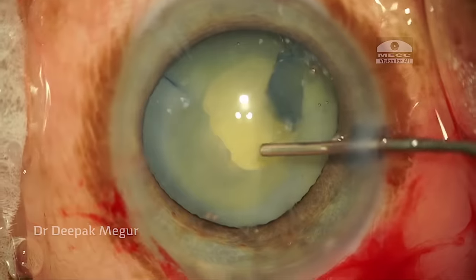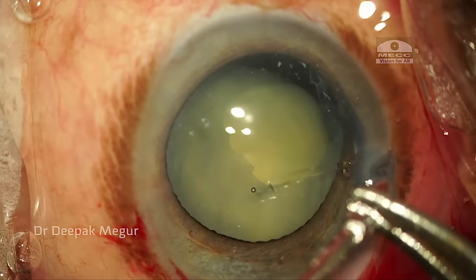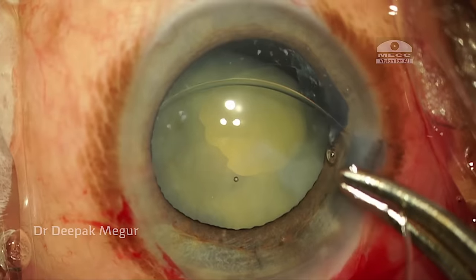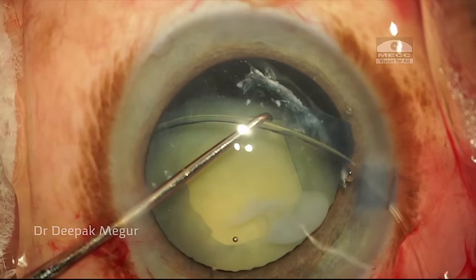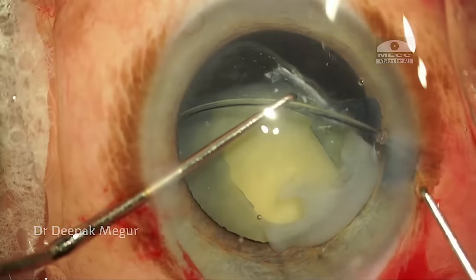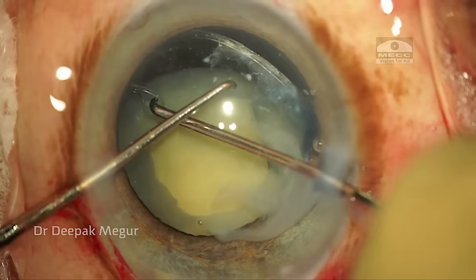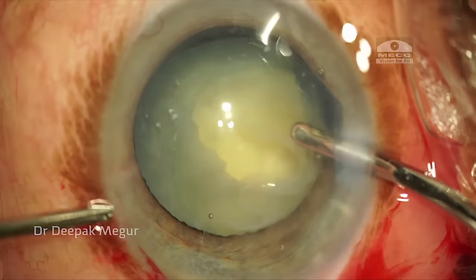My plan B is to put in a CTR ring now. After creating some space under the anterior capsule, I am threading in the CTR into the capsular bag. I always use my second instrument to compress the ring while dialing it inside, to prevent stress on the healthy zonules. I can see the ring passing through the equator of the bag, and I want to dial it well beyond the area of zonular dehiscence so that adequate support to the weak area is provided.